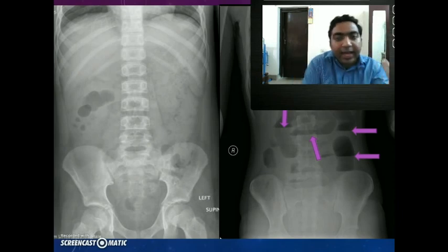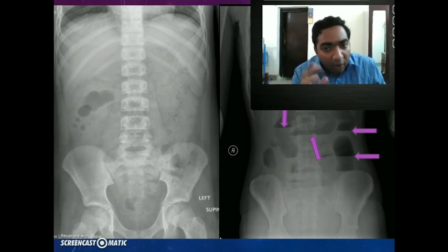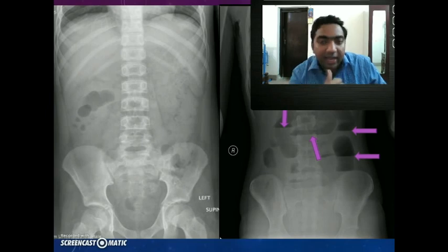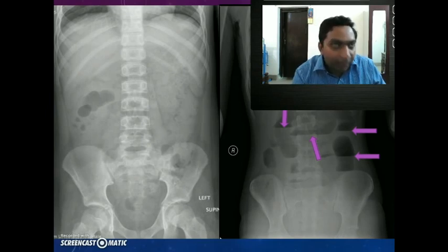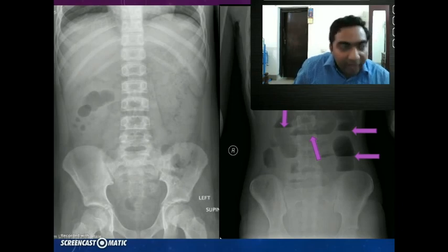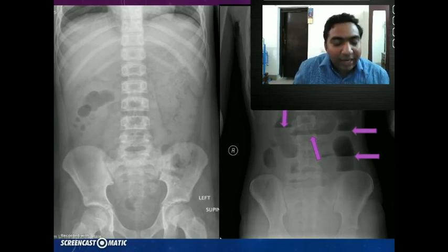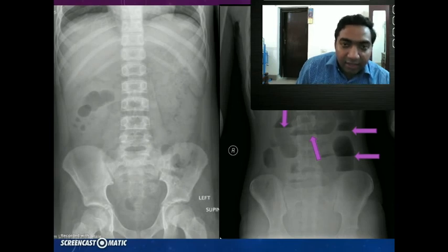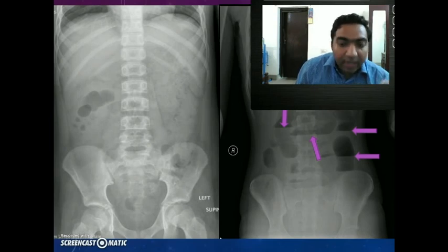Are there areas of stasis in a normal abdomen? Yes — at the points of sphincters, at the ileocecal junction, near the pylorus, we may see air fluid levels. So when we see two air fluid levels, it may not be pathology. But when we see three or more air fluid levels, we call it multiple air fluid levels and there is a chance for intestinal obstruction. Arbitrarily, six air fluid levels suggest intestinal obstruction, but more the number of air fluid levels, the greater the chance for intestinal obstruction.